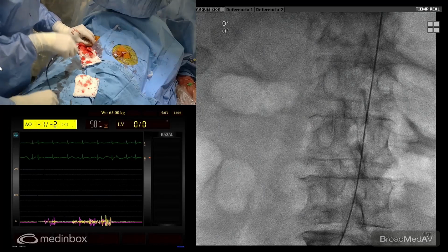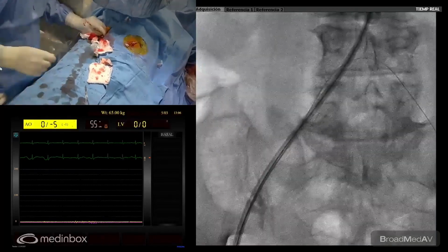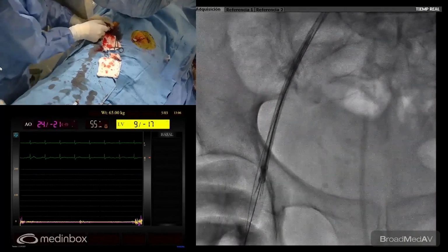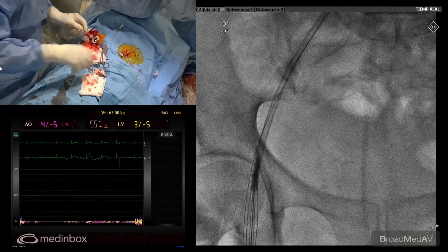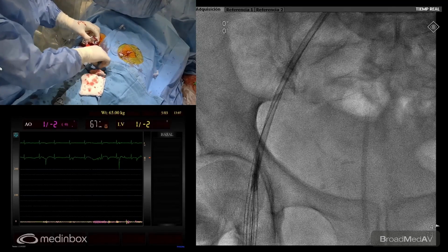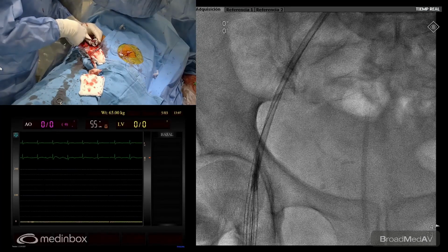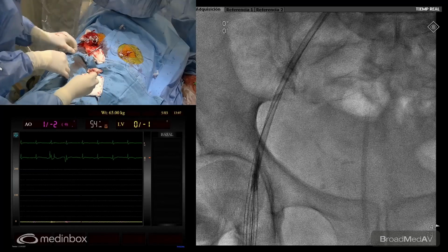Okay. We are going to need the Amplatz with a short tip. I have backflow here. I close it. And now I am here. I pull the needles out. And now I have the needles here. Forceps. If you can zoom here, what I am going to do now is to pull these needles out. While I have the 4 needles out, I cut the thread.